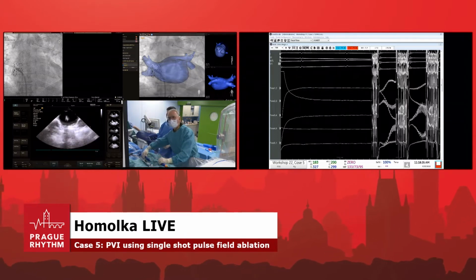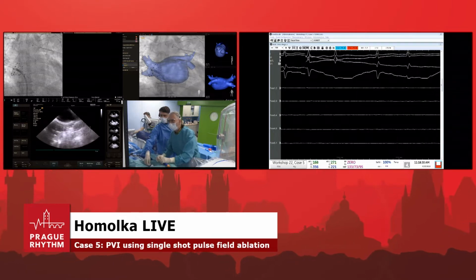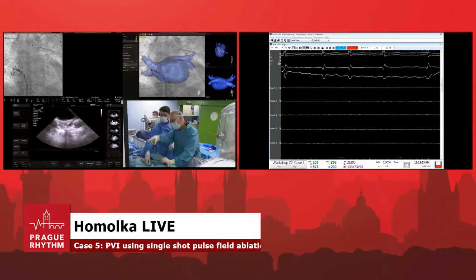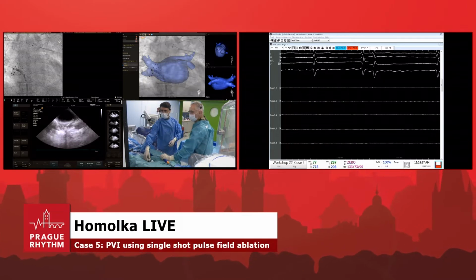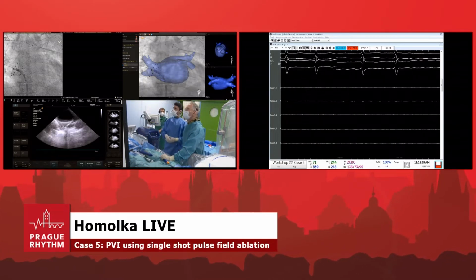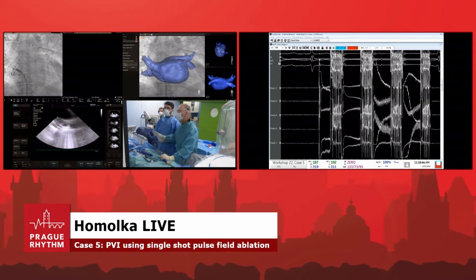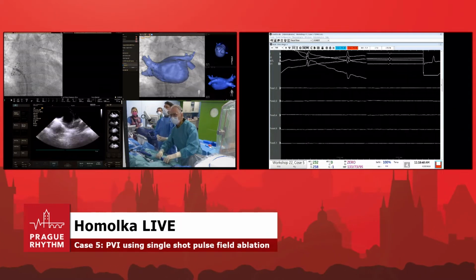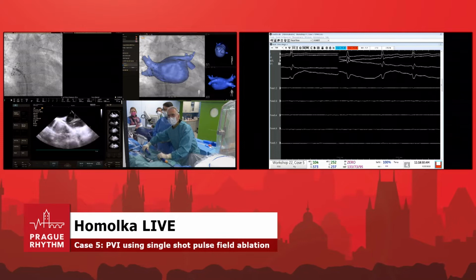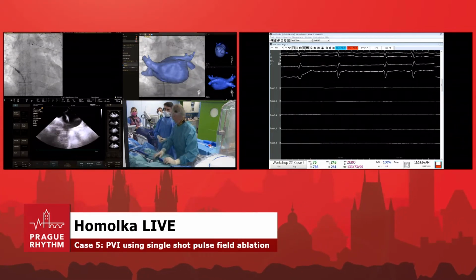Okay, I will rotate, perfect, and I will make a little bit more. Okay, now I'm covering the inferior better. I was worried about the inferior part. Okay, so in 3 minutes it's perfect, Pepo. It's perfect, while we are going to the posterior wall, okay? So, done?